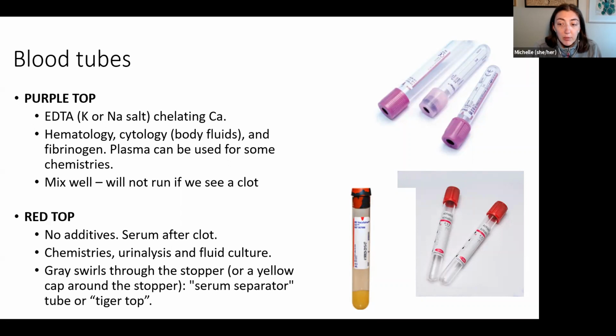And then the red top, so there's no additive. As I said, after it clots and you spin it down, you get serum. This is what we use for chemistries. Also, you can put urine in these. There's just nothing in them. Fluid cultures.